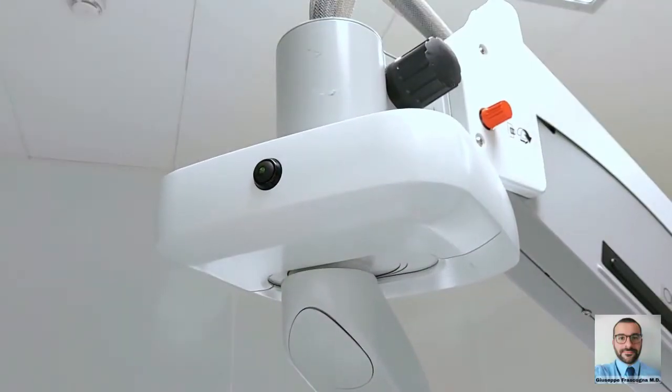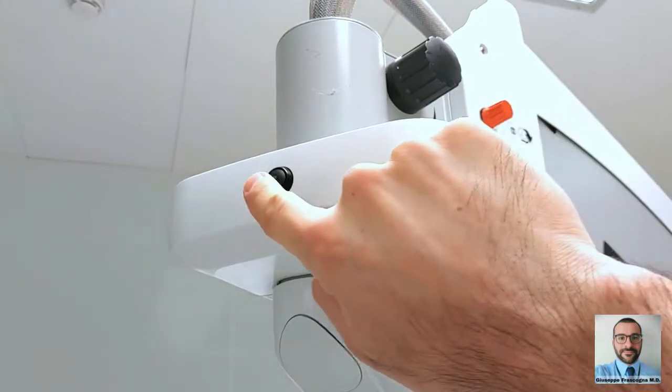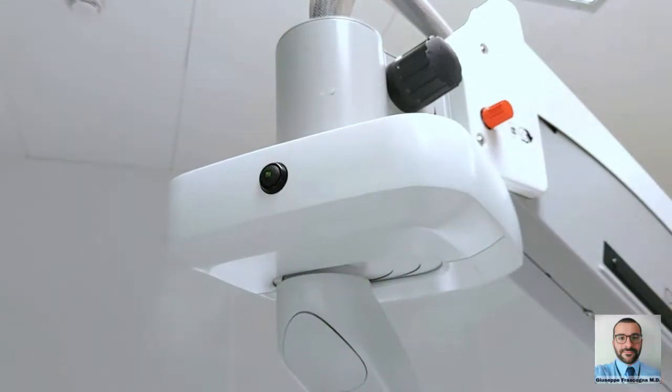After every surgery, you have to press the reset button of the XY joint, which resets the position of the joint and also the zoom, focus, and lights.